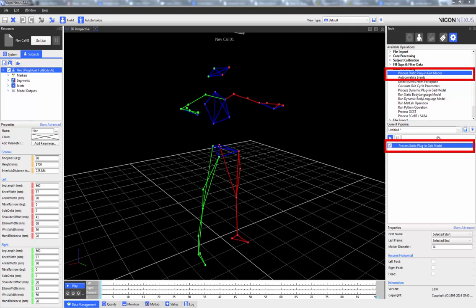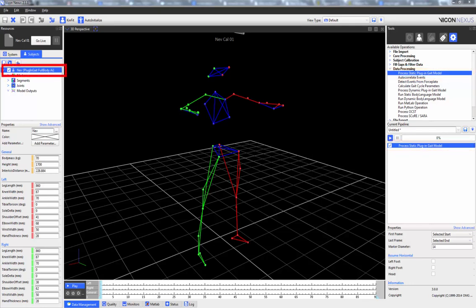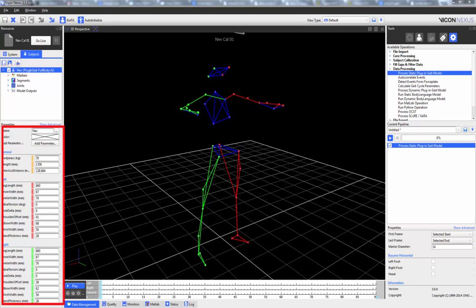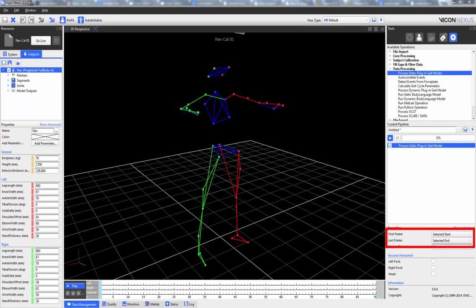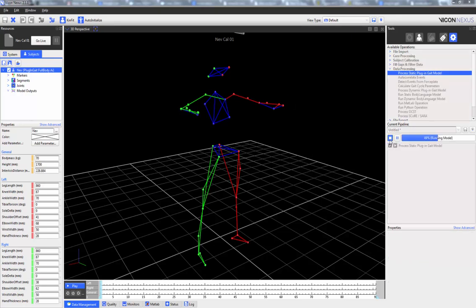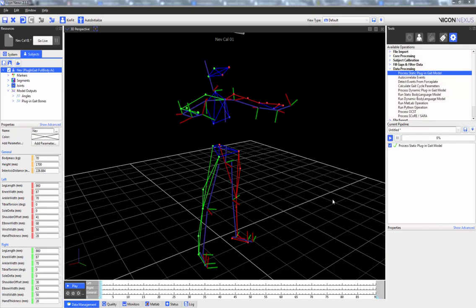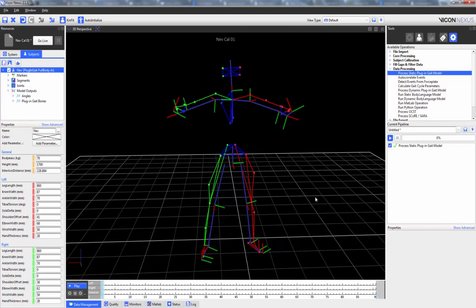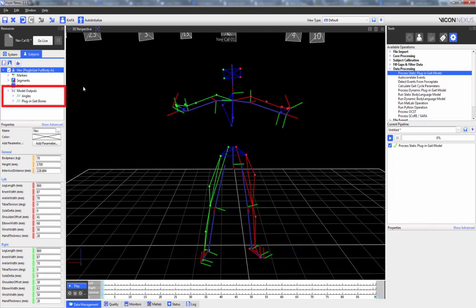The Process Static Plug-in Gait Model pipeline operation can be used once the VST containing the markers needed for the Plug-in Gait model have been attached, the subject properties have been entered, and the markers have been correctly labelled. The properties we can adjust are the first and last frame, the marker diameter in millimetres, and whether the left and right foot and head segments are assumed to be horizontal or not. We can see that the static Plug-in Gait model has been run and new model outputs such as angles and the Plug-in Gait bones are now available.